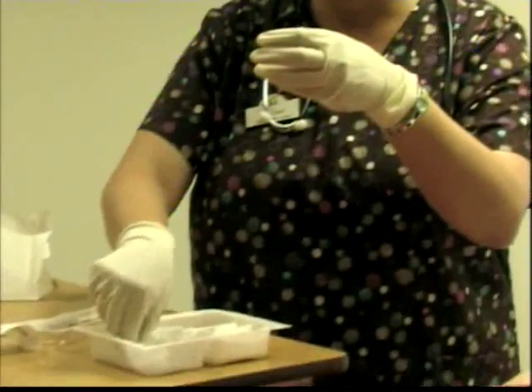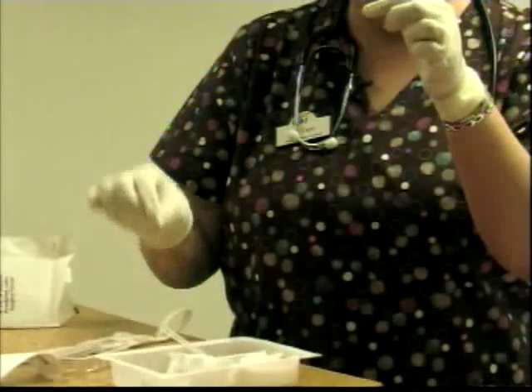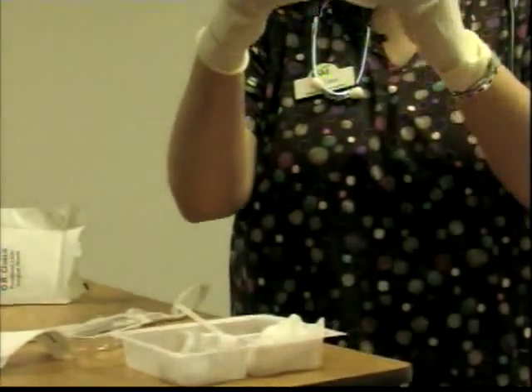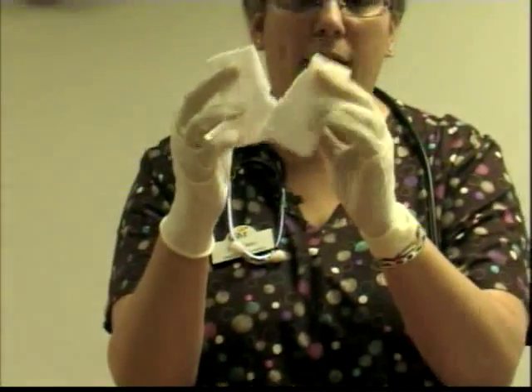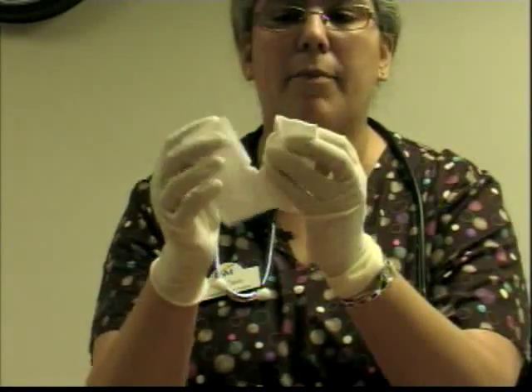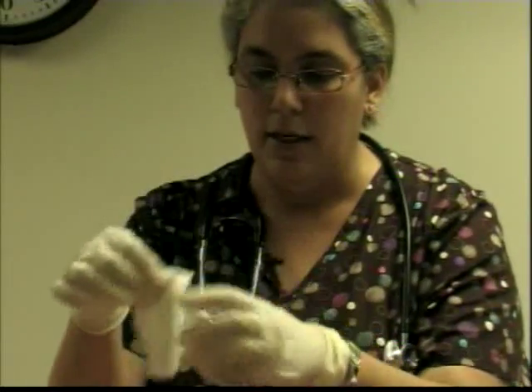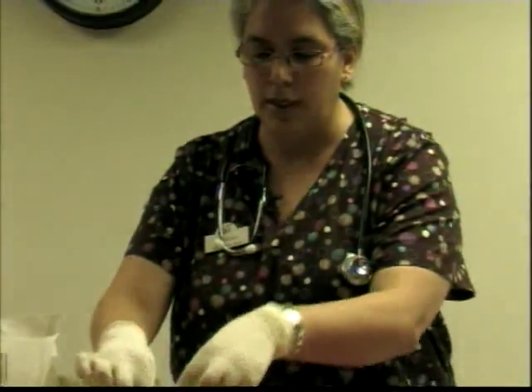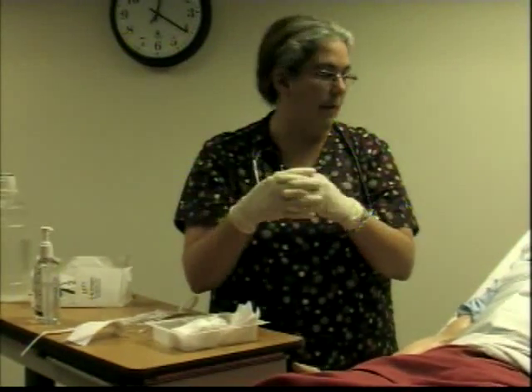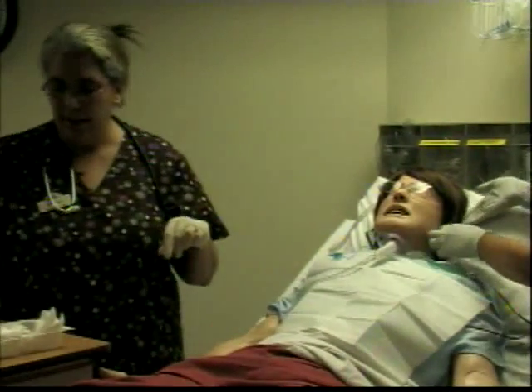We have the two cotton tip applicators that we're going to put right here into your water. You have the split gauze, and I wanted to talk a little bit about this. You want to make sure that you use the one that comes directly for that. You don't want to get a 4x4 and cut it in half, because that will create some filaments that can go inside the stoma and create issues for the client. So this is the one we're going to be using when we're done cleaning. And the 4x4s that you have extra in here, you can use to help you dry and clean up. So we have this already in place. My assistant is going to help me.